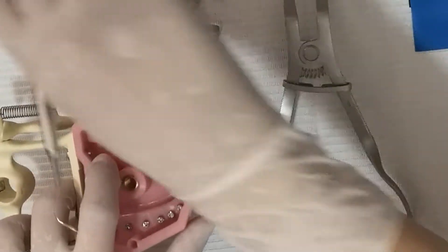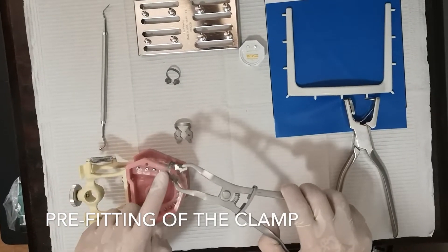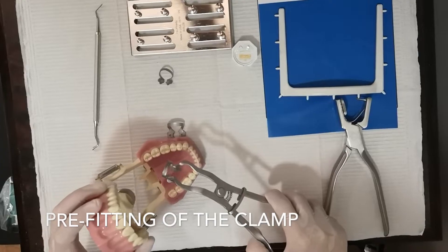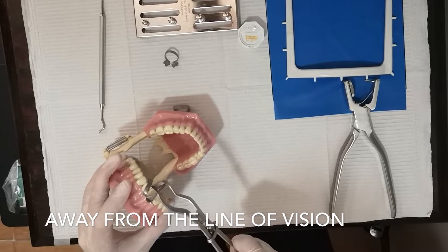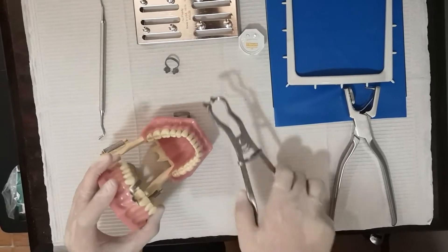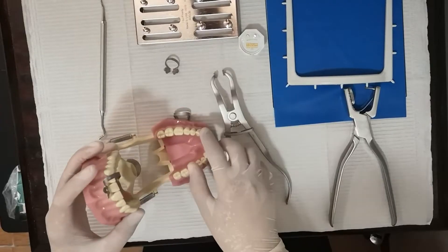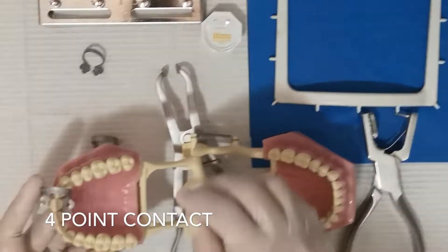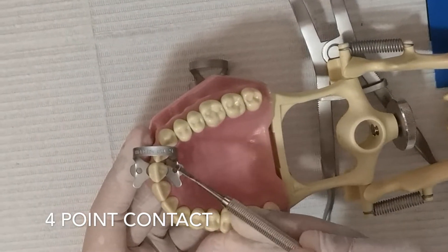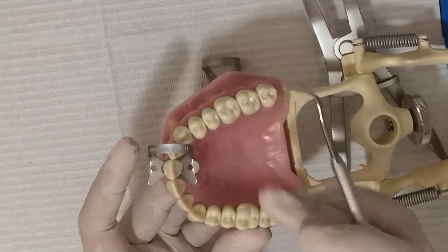After we have selected the clamp, we have to try to pre-fit it. Make sure that the bow is on the distal side of the tooth — away from our eyesight. Place it labial and then lingual. After we have placed it, we have to examine if it will have the four-point contact. Make sure these four points are in contact with the tooth. It should be hugging the tooth and not the gingiva.